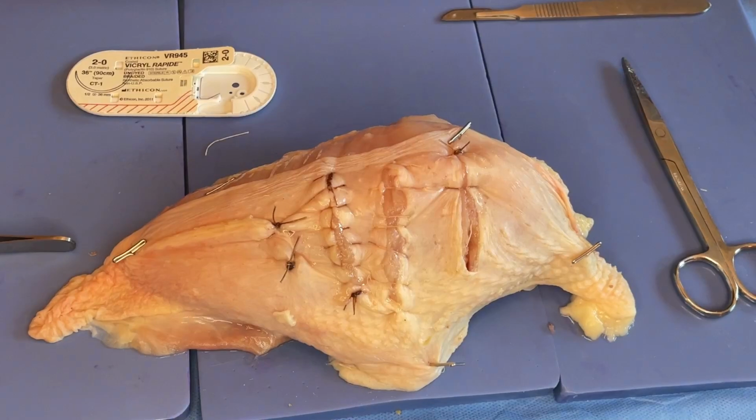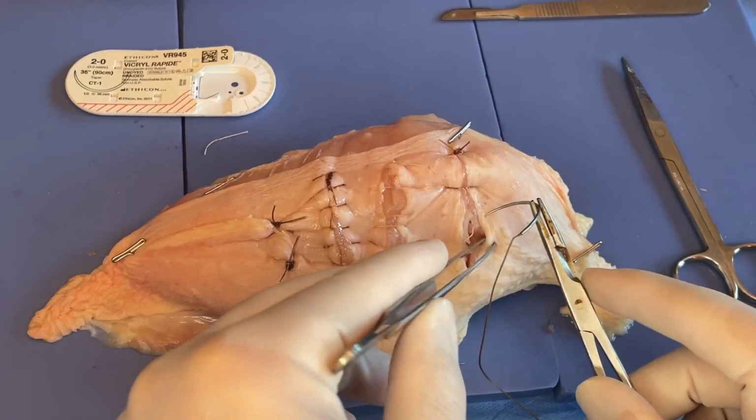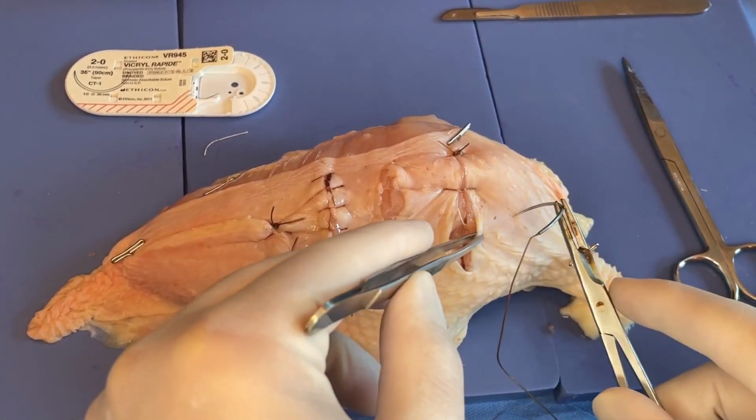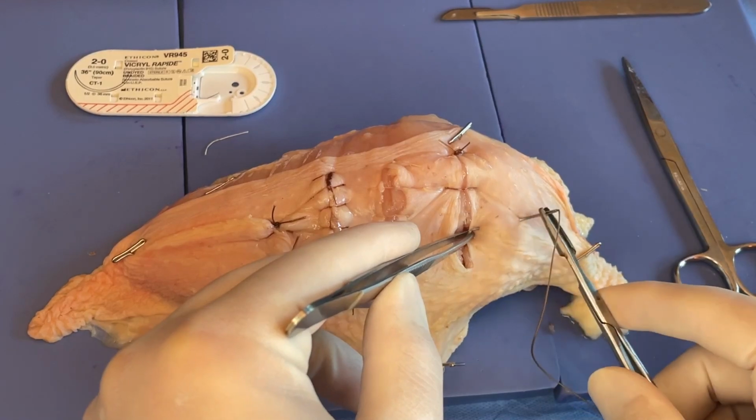So let's contrast that to a vertical mattress, where our bite is perpendicular to the defect. But again, we don't come in here and then come out in the defect. That would just be an interrupted. What you do is you actually come in and out here.